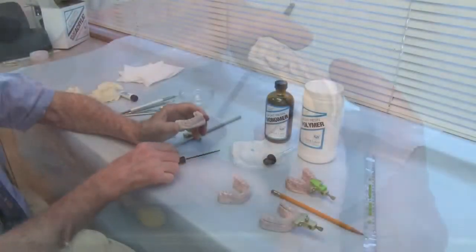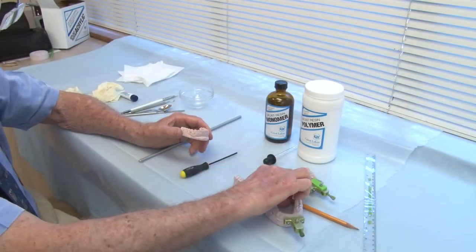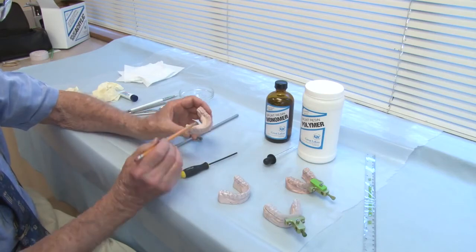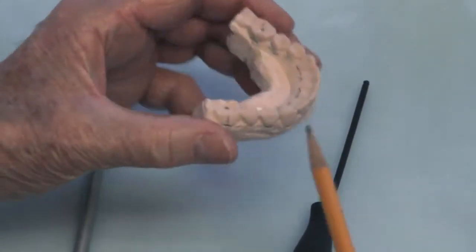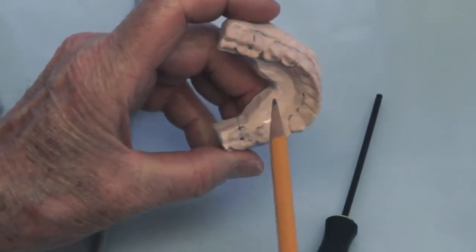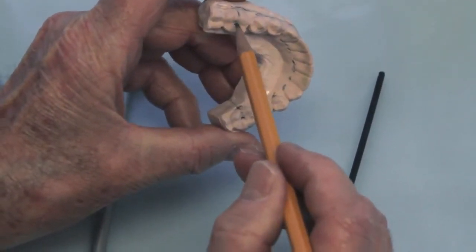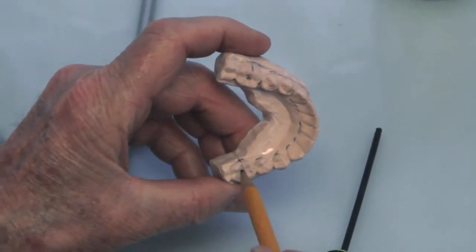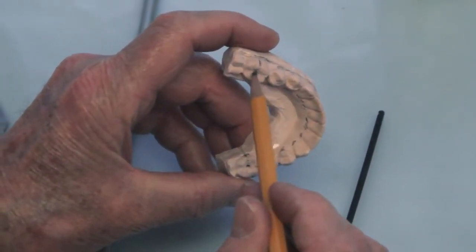After I get a good lower model, I want to mark the cervical area on the facial and the lingual of the lower model. I want to locate the central fossa of the lower first molars. And now I want to be able to transfer that location to the back of the model.